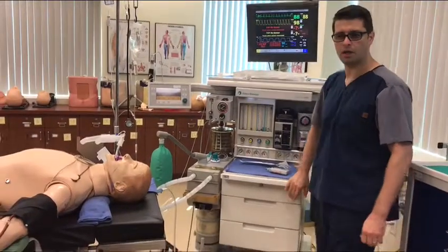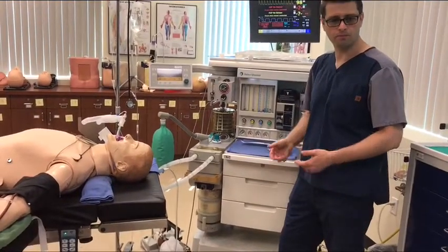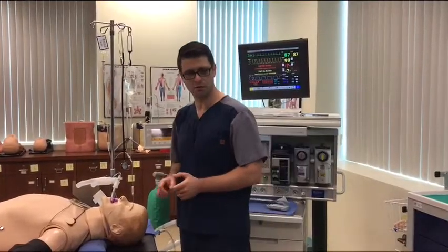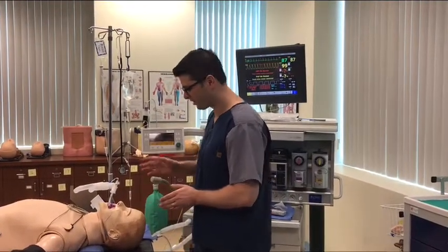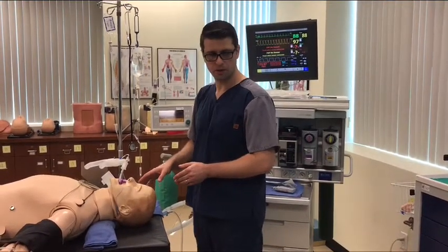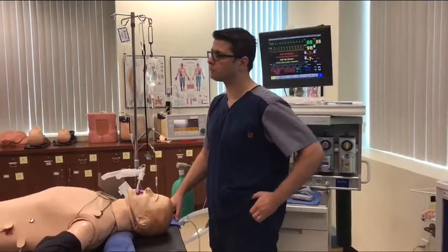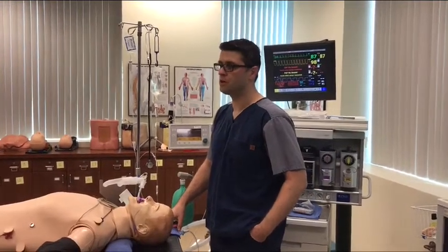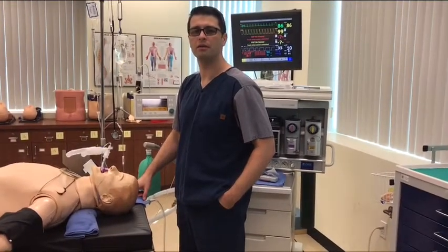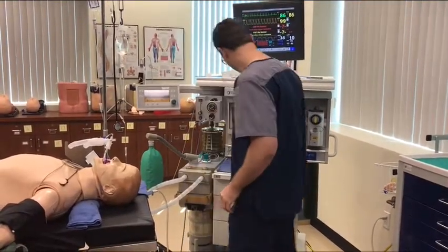Did we already give all the medication? I didn't hear it. Okay, sorry. Then this is what I was gonna do. Give him the reversal medication. How much? How many kilograms? Check your twitches. We better probably find that out. What did you say? Check your twitches. Yes.